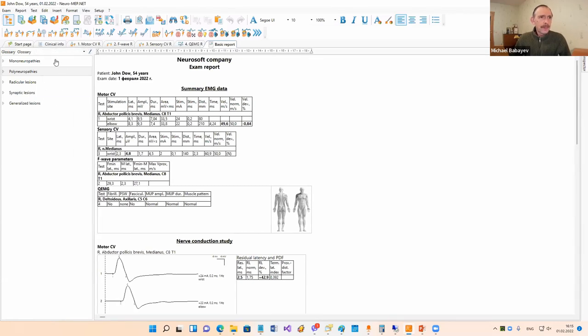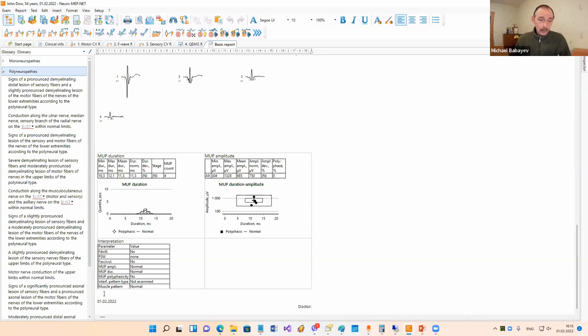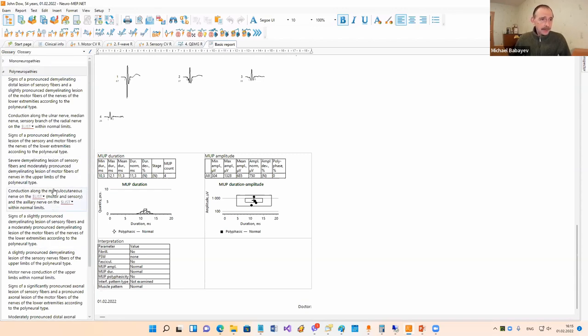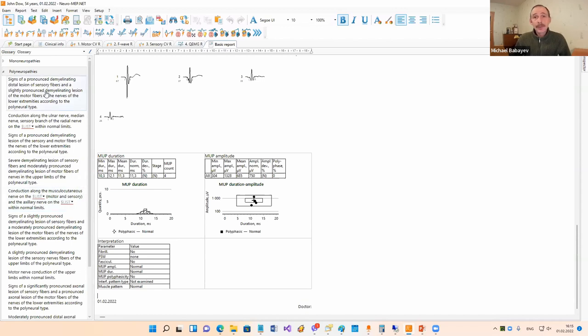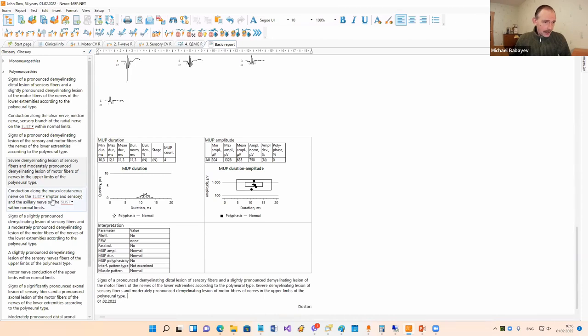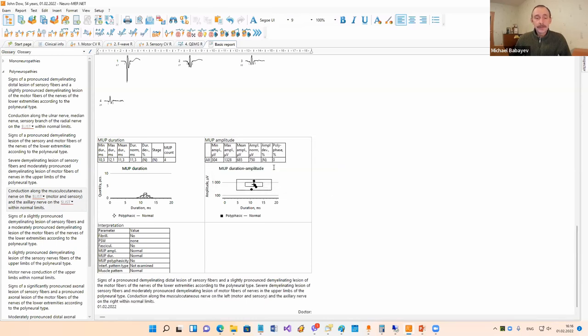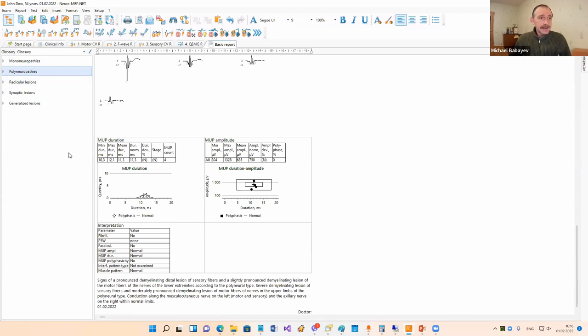I'd like to show you a new feature. Now in the glossary, by default we have a lot of different phrases, and it's very easy to input these phrases into the report. First, I click in the point where I would like to input the phrase to place the cursor there. Then to input a standard phrase, I only make one mouse click. You can also use phrases with lists - we make one mouse click and then select a side: left side or right side. All these lists are customizable, so you can add your own phrases or change existing ones with this small button.